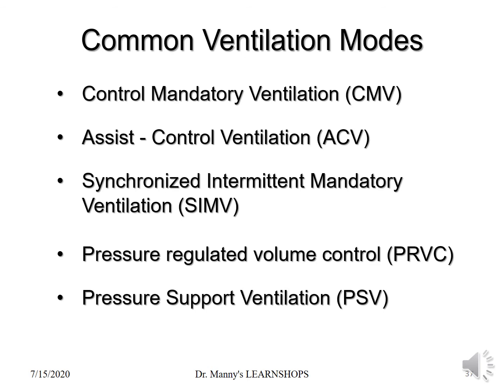Then you've got IMV, intermittent mandatory ventilation, which has been extended to synchronized intermittent mandatory ventilation. But basically, there's intermittent control ventilation, but it's synchronized to the patient's breathing efforts or attempts to make it a little bit more user-friendly, so the patient becomes a little bit more cooperative. Then you've got pressure-regulated volume control and pressure support ventilation.